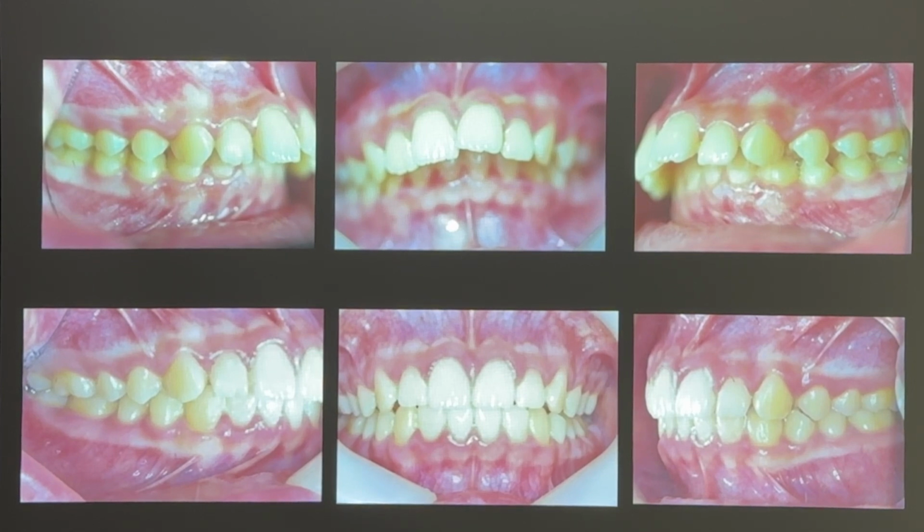So please use the tongue blade or mirror to check, insert the tongue blade and push down the major part of the tongue, and then you can check the tonsil and uvula over there.